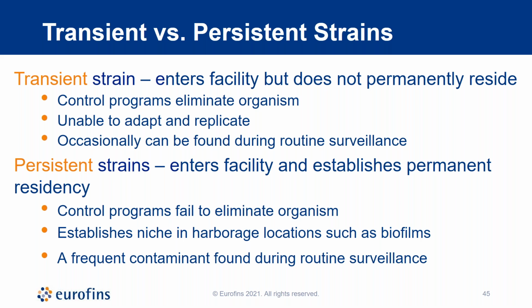And we've had some very, very high profile outbreaks because companies were doing relatively decent environmental testing on non-contact surfaces, but they were following this religion. They didn't know that they were routinely adding persistent resident strains of pathogens into product, and they weren't detecting it through in-product testing.